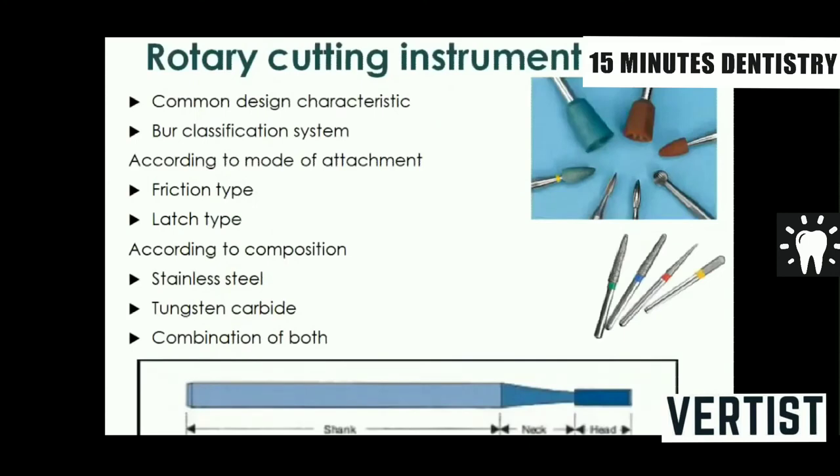We all know about the rotary handpiece and burrs. Rotary cutting instruments were initially called burrs.